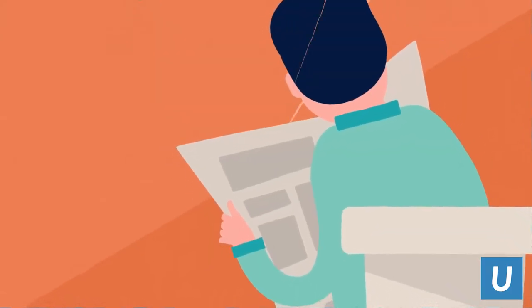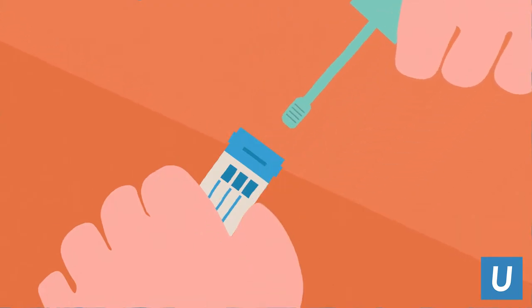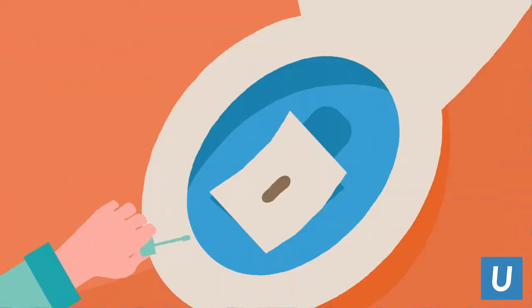Twist the green cap on the sampling bottle to open the bottle. Collect your stool sample before the paper sinks by scraping the surface of the stool sample with the wand attached to the green cap.